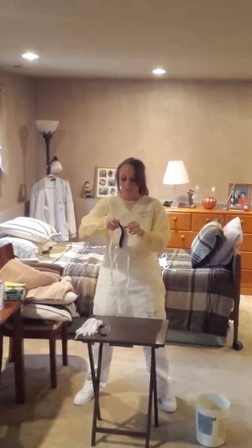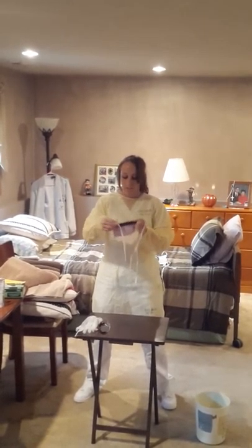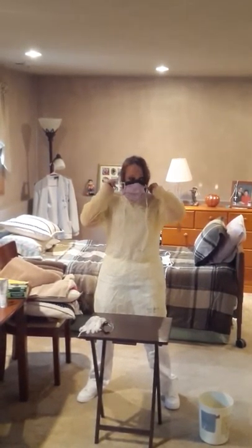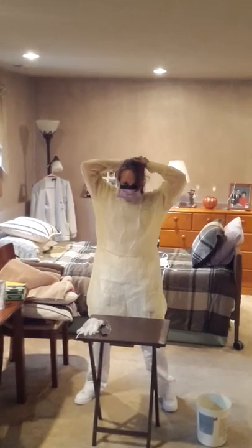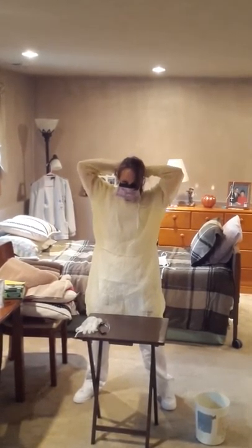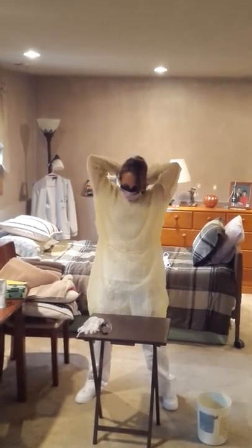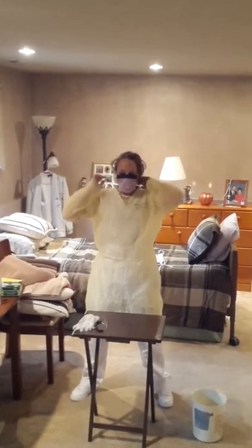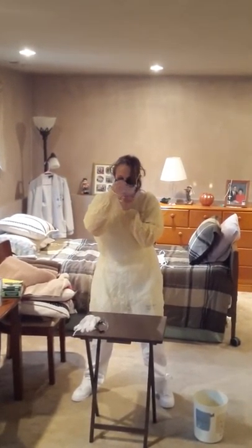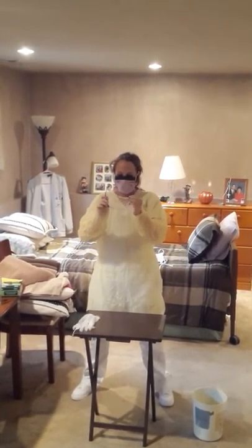Next, I'm going to put on my mask. Assuming that your mask does not have a shield, you're going to put on your mask and then goggles. You're going to tie your first fold above your ears and your second fold behind your neck. If you do not have a shield on your mask, you're going to put your goggles on next, making sure that they are over top of the mask.